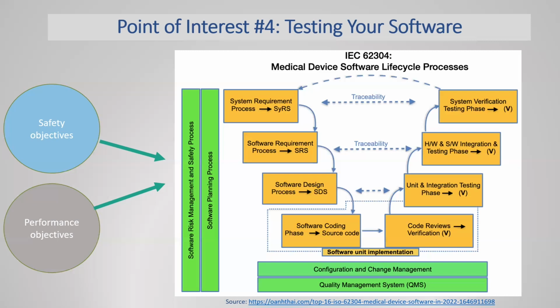I would say the main goals to keep in mind with respect to safety outcomes are cybersecurity and any direct or indirect impact that the software or connectivity issues could potentially have on the patient or the ability of the healthcare practitioner to treat the patient. So keep in mind that includes any impact to the information collected, patient records, data, anything that has been collected that could affect treatment or diagnosis decisions as well.